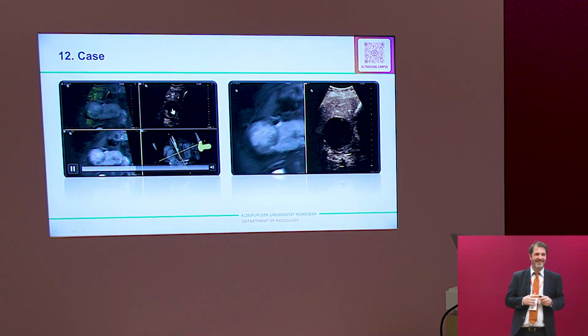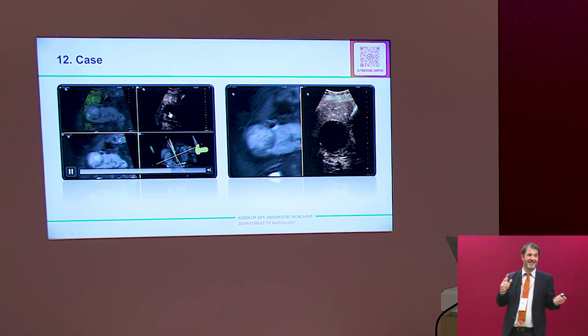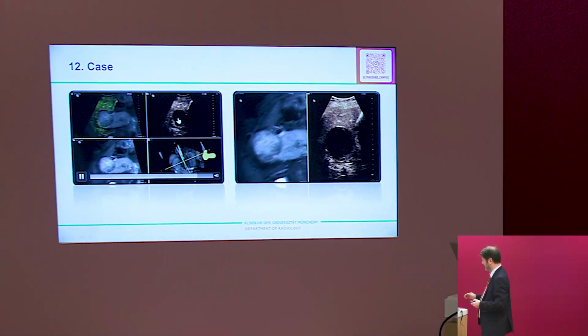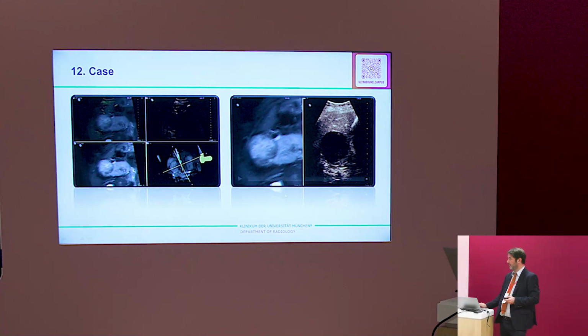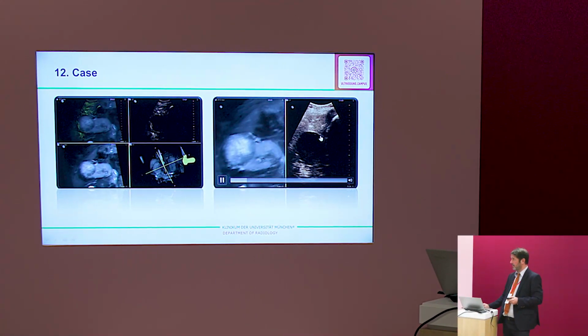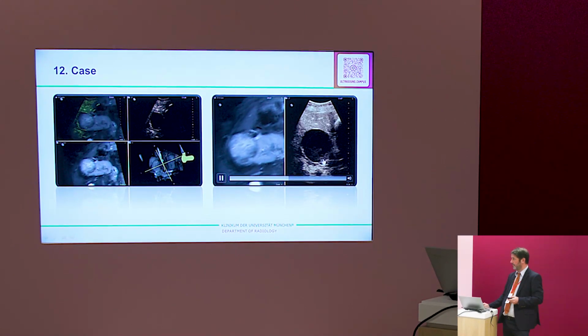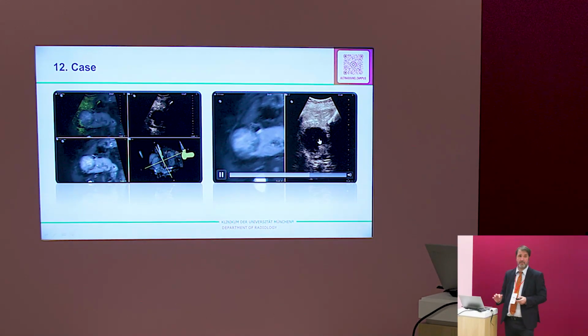We have uptake around. Yeah, but inside it's dark. It's not visible. Right? Yeah, but if you wait a little bit longer, it's a tricky case. You see here, bubbles, you see there? And also here, there, it's alive.